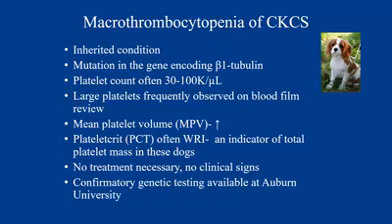Now, certainly something that I didn't bring up is the analyzer will give you a mean platelet volume, or your MPV, and your mean platelet volume will increase because these platelets are big. But the reason why you need to look at a blood film is because platelet clumps can get counted by the analyzer as a single platelet. And if it does that, it's going to drive your MPV up and look like big platelets. So again, you can't just rely on your analyzer data to prioritize this diagnosis. You need to make a blood film, all right?